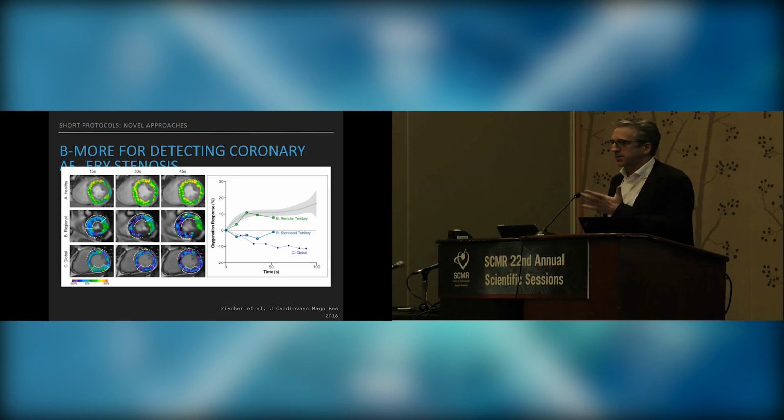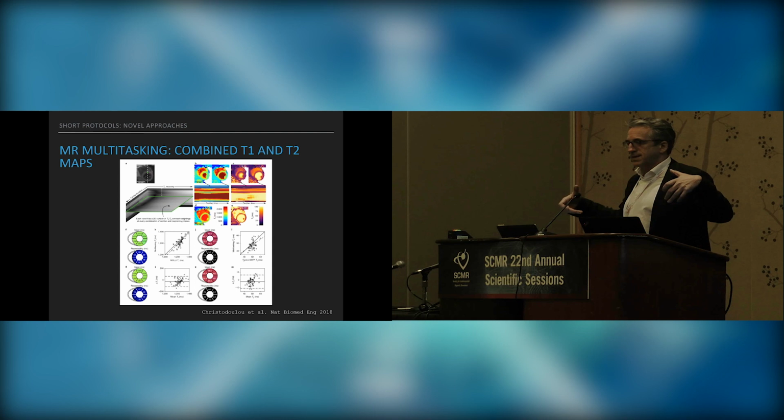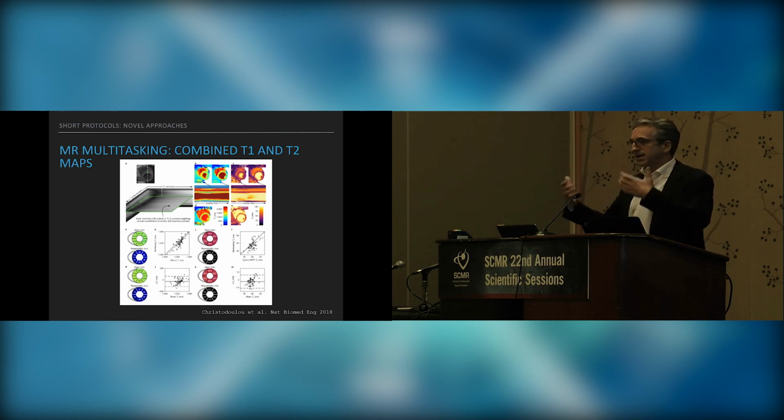So this would be another way to increase speed, and another one is multitasking. If you take that all together, multitasking, as I said before, may allow you to generate a 3D data set. They still need about 20, 30 minutes, but let's say in the future 15 minutes, and then you have all the images calculated. Now, of course, a problem with that is if you generate 400 or 500 images in 10 minutes and do that 20 times a day on your scanner, that's a lot of data, so you need to deal with that. So we will need to catch up in the future with software that allows us to digest all that and basically present it in an understandable fashion.